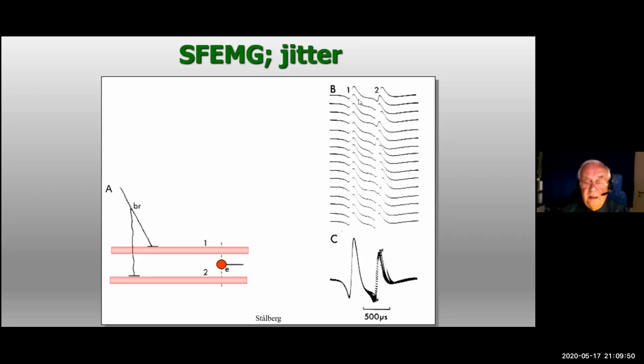And then we get this type of recording from one fiber and from the other fiber. And that is so all the time when they are repeated, let's say with 10 hertz. But when we look at this very, very carefully, we see a slight variability in the time between the first and the second signal. And that is much better seen when we superimpose. Here we trigger, that means start the sweep on the first signal, for example, and we see that there is a blurring here.